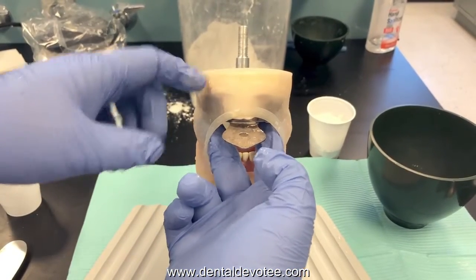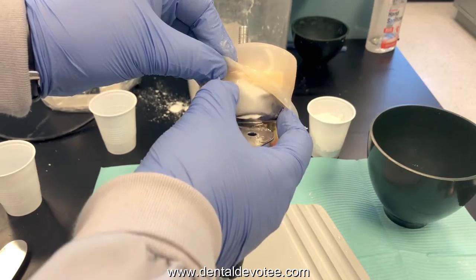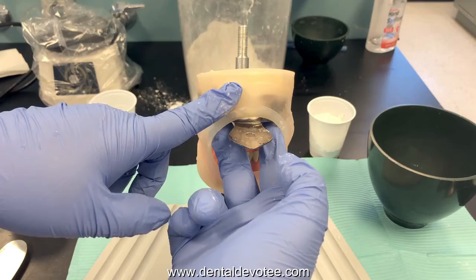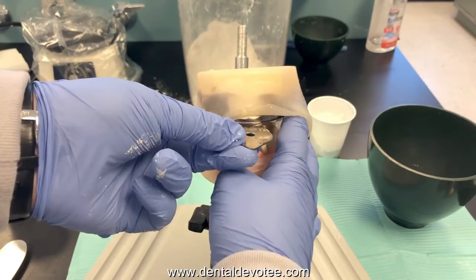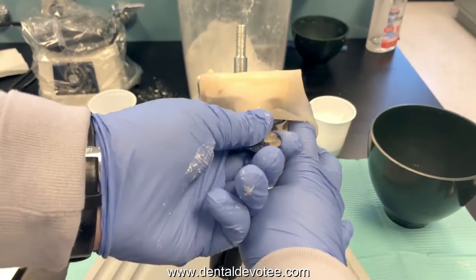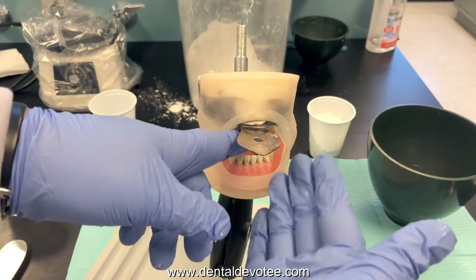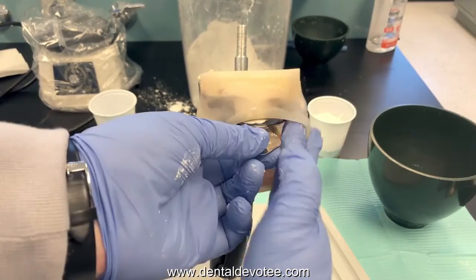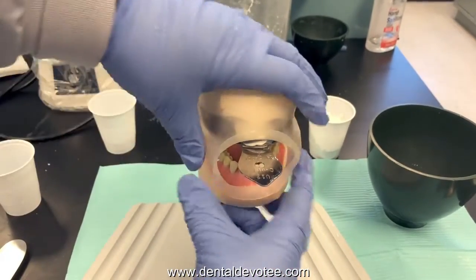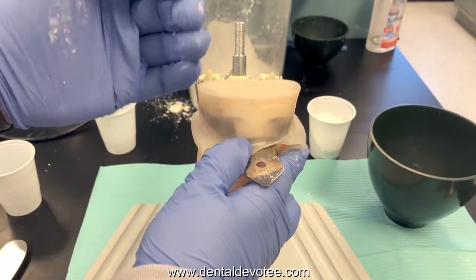When you're ready to remove the tray, first determine that the material is set. You can see the excess material above the tray — if it feels firm and resilient and you can't dig a fingernail mark into it, it's ready to come out. Take an index finger on the posterior corner of the tray, making sure you're pulling on the tray and not the impression material. Use your other hand to give a firm pull down. Keep your fingers between the tray and their opposing arch so the metal tray doesn't accidentally snap down and hit their teeth. If you get a good suction seal, your patient can close their lips around the tray and blow to force air up under the impression to help loosen it.